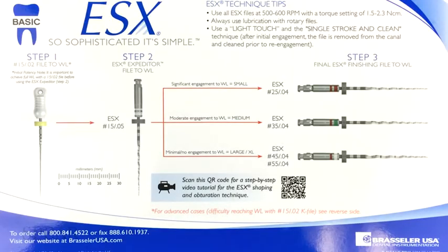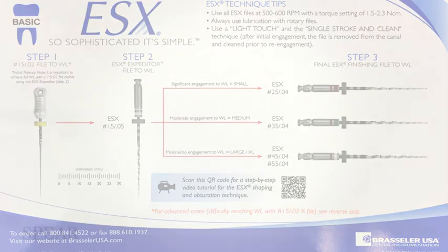But that's the basic essence of the basic ESX protocol, which is a very straightforward protocol, and it's available for you on a technique card that the manufacturer makes. It's made by Brasseler, and Brasseler has these technique cards that describe what I just mentioned in terms of the protocol, what's best to use.